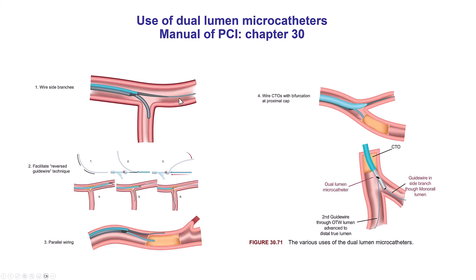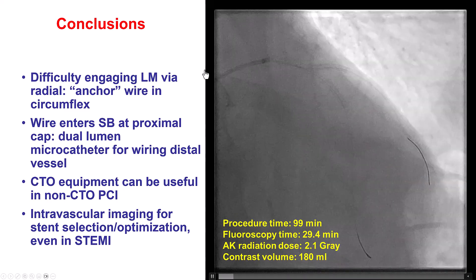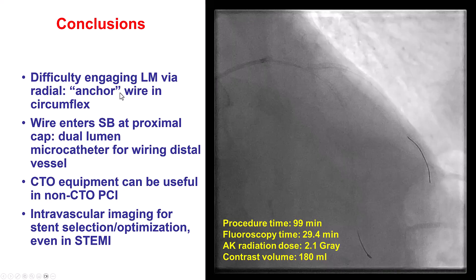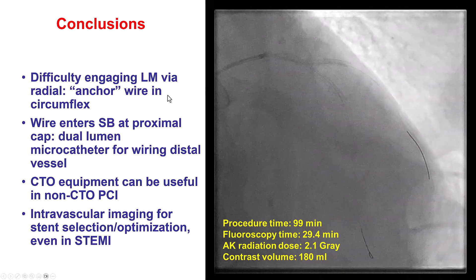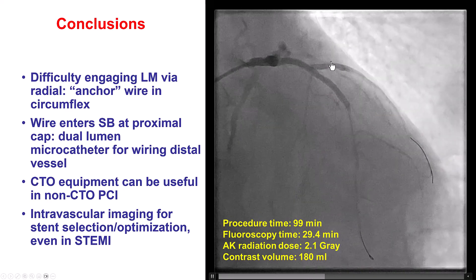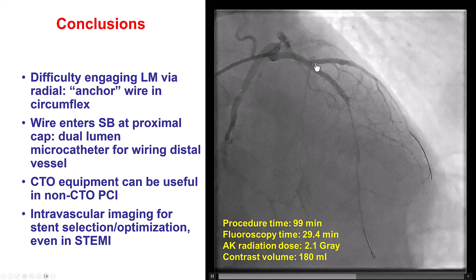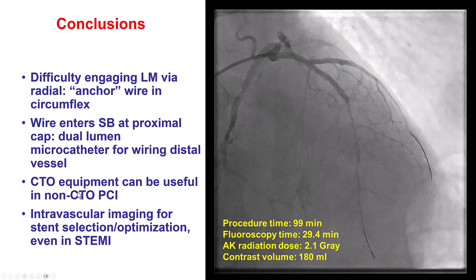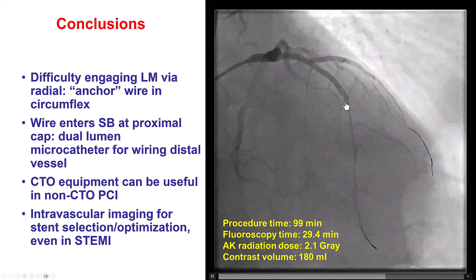The technique we used involved a dual-lumen microcatheter. We advanced the Sasuke into the side branch, and then we had a second guidewire — the Gaia NX2 — to go through the over-the-wire lumen of the dual-lumen microcatheter, and that wire successfully crossed into the distal true lumen. Multiple lessons from this case: when you have difficulty with engagement through radial access, one technique to stabilize the guide is to advance a wire into another vessel — for example, the circumflex — and use it to anchor the guide. Once you have a wire at the side branch of the proximal cap, one can use a dual-lumen microcatheter, a Sasuke in this case, along with a CTO wire, the Gaia NX2, which is a 4-gram wire, to wire through the LAD culprit lesion.